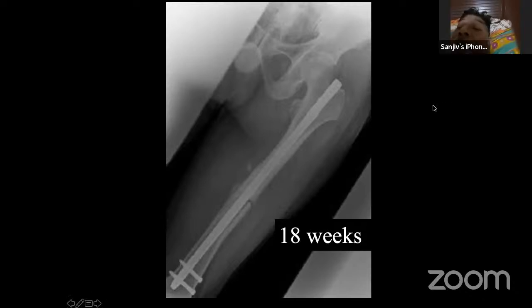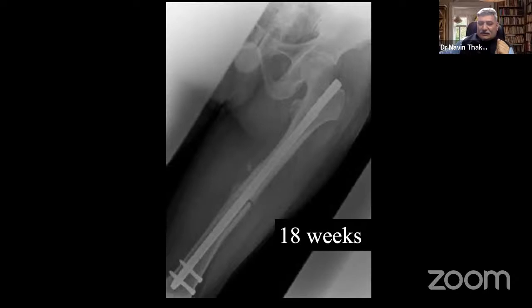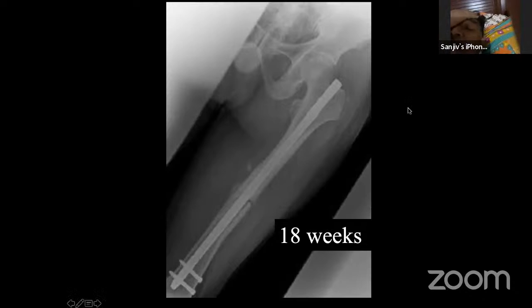So you say that probably the decision was wrong. Dr. Gore is speaking. I think at 18 weeks, if this is the picture, I'll do exchange nailing. You do the exchange nailing.